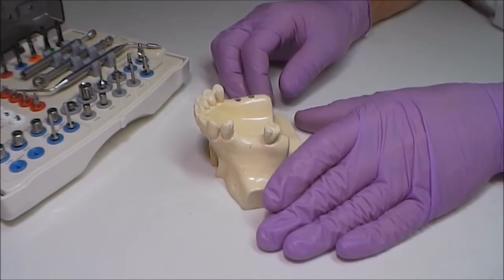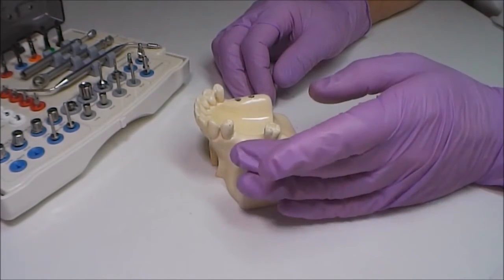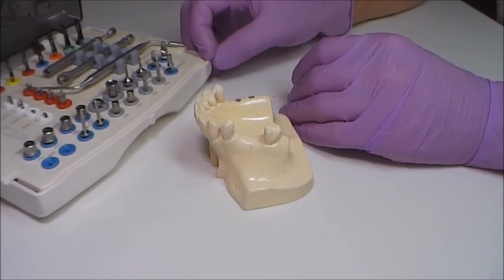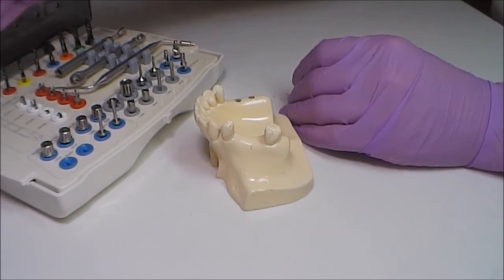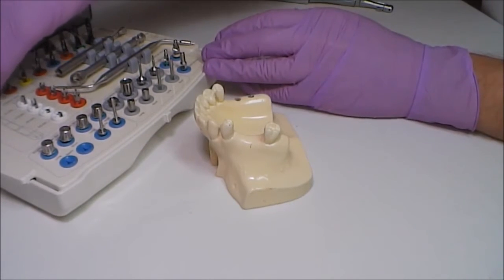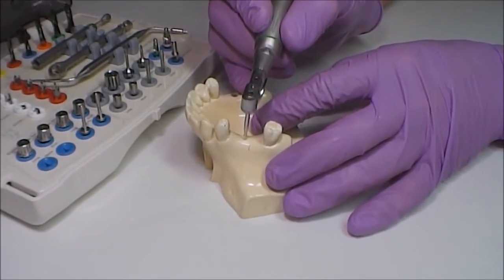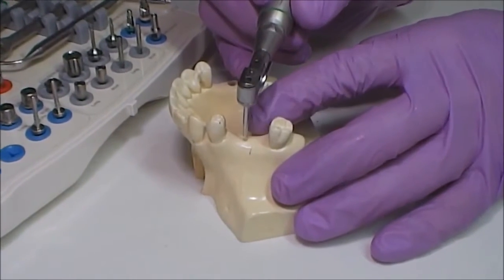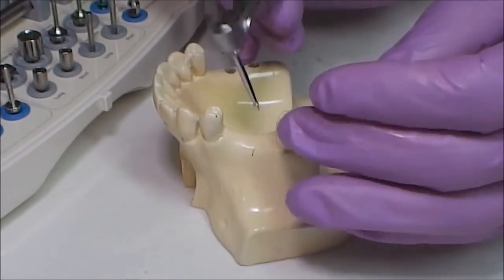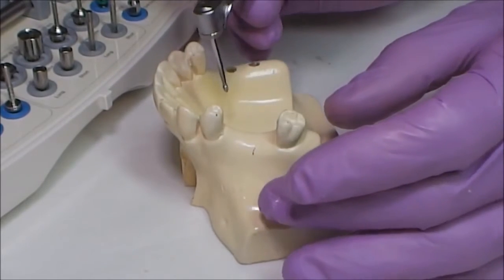This is a drilling practical for a 5.5 millimeter diameter implant without installation. We are going to demonstrate the order of drilling of a future implant site with surgical drills of various diameters. To perform that, we should follow the classical surgical protocol. We take the marker burr, which is needed to mark the place of the future implant. If we don't mark the place with this burr, the next drill will slide off the alveolar crest, making correct drilling for implantation impossible.